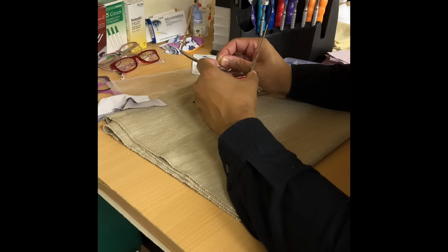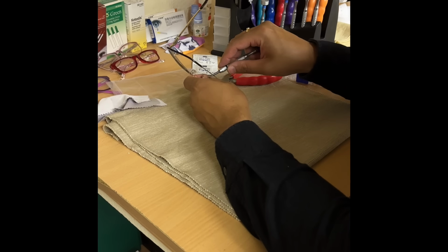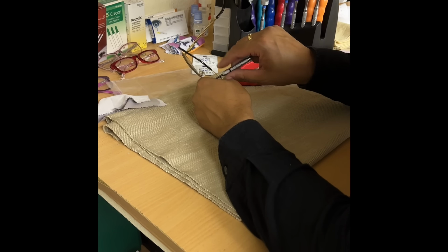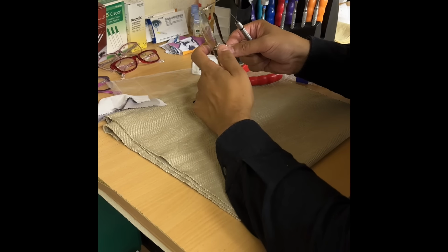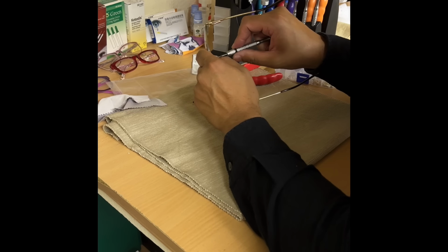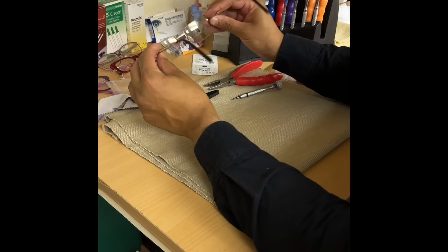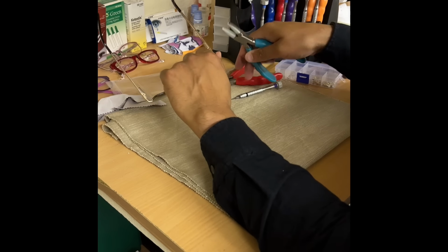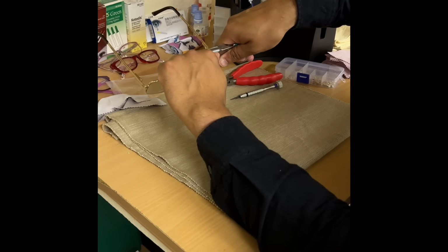As you can see, if you have big fingers, this can be tricky. Okay, that's going in nicely. Let's return to the other one, which did give us a little bit of aggravation. There we go. 2 new pads for your enjoyment. Got to level off this side a little bit for you, clean the lenses, and then you can try them on, see they're fitting.